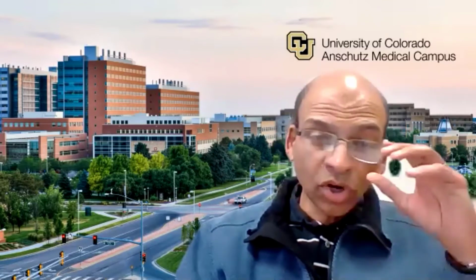The second thing is that technically, after speaking with Dr. Bapaye, there's a lot of nuances and learning curve. And even in expert hands, he and I were talking, it also took them a few procedures to learn how to do this without any serious adverse events. Not just that, the endoloop that is available in the United States, if that were to be used for this procedure, you need to have that endoloop outside of the scope and catch it with a clip that goes through the channel of the scope. And that has to go through the tunnel into the peritoneum.